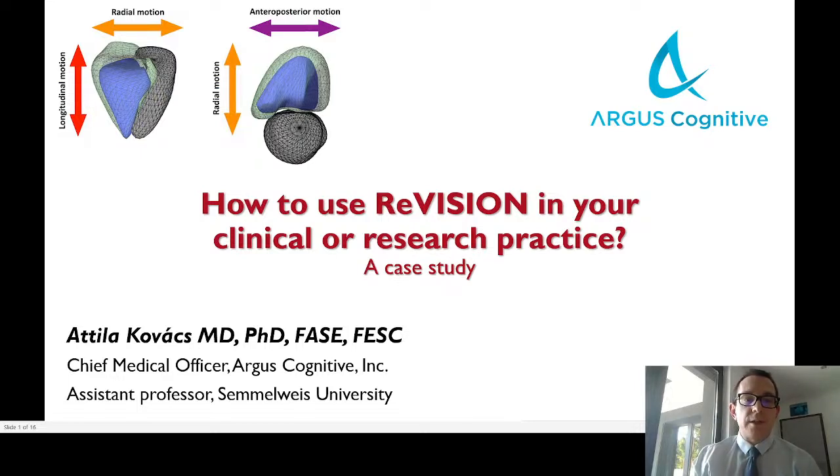So the topic of today's webinar is how to use ReVISION in your clinical or research practice. Actually, I would like to highlight not just a case report where the diagnostics provided by ReVISION was helpful, but also to show you how easy it is to use our software in relation with your Echo lab's infrastructure and how to get the ReVISION results using your existing infrastructure at your Echo lab.